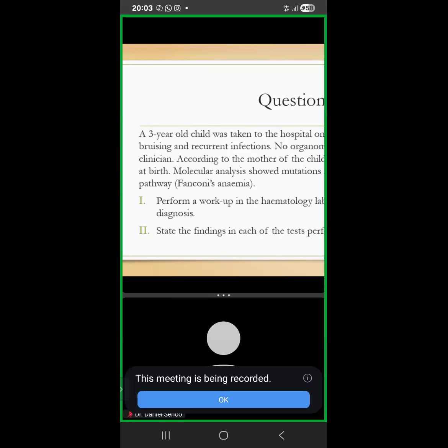If we examine that, we might see that the numbers are also reduced on the film, because the film is a validator of the full blood count machine. That is a machine, though.